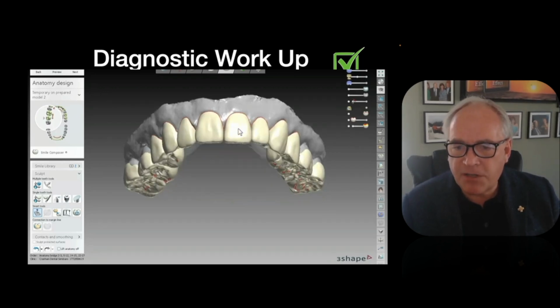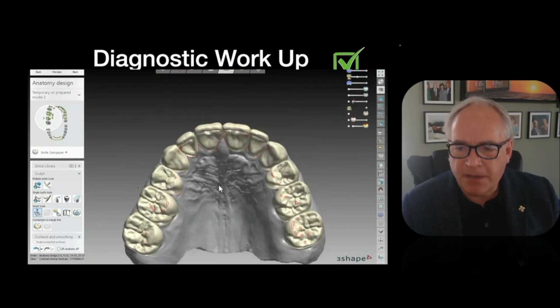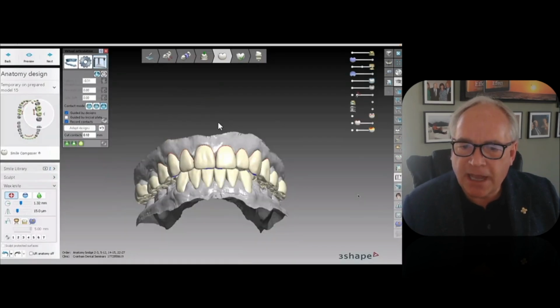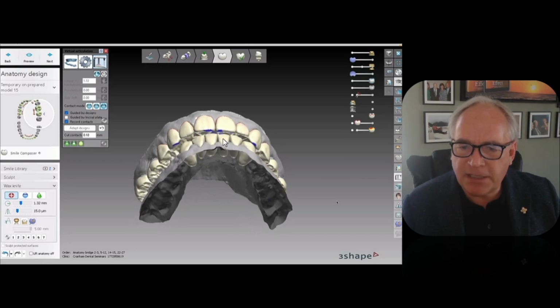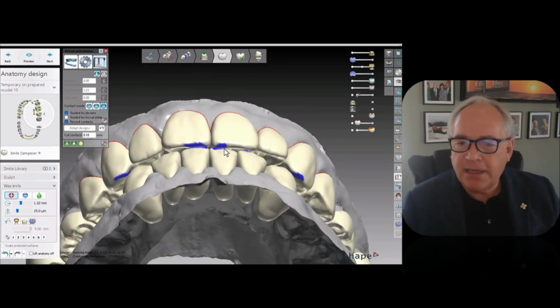We also are visualizing some restorations first bicuspid to first bicuspid in the bottom, but you can see how we can design specifically good centric stops all the way around. Equal intensity stops and guidance principles we'll get to later. We believe in anterior guidance, so we're going to illustrate canine guidance in this place, make sure that they can't rub on back teeth. I'll explain why in the next section.